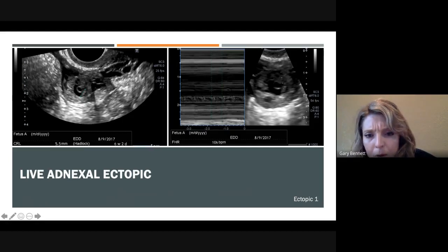So let's talk about the M mode on the heart rate on this picture. In theory, it should be exactly across the screen on the M mode. So the way this is supposed to work is that we have the gestational sac here, right where it gets dark here, and it should be across through our line here. So really this is kind of supposed to be across from there, kind of supposed to be across from there, and this is supposed to be across from here, all the way down to the bottom, right underneath, and then when it gets echogenic, that's supposed to correlate with the echogenicity on this side of the screen.